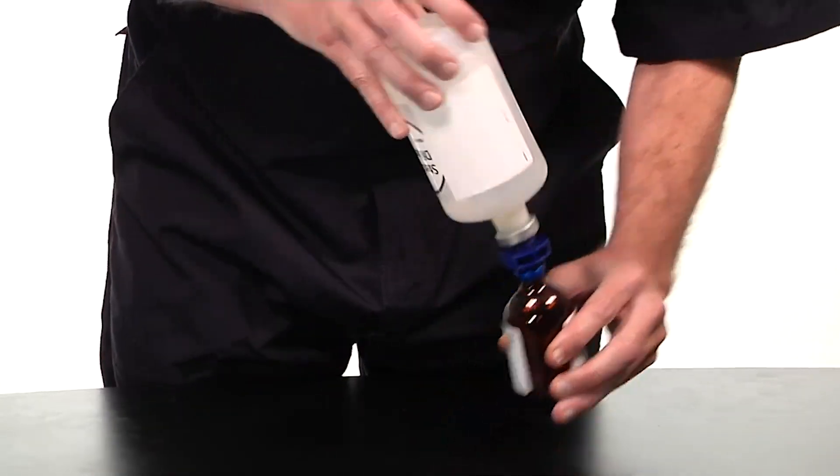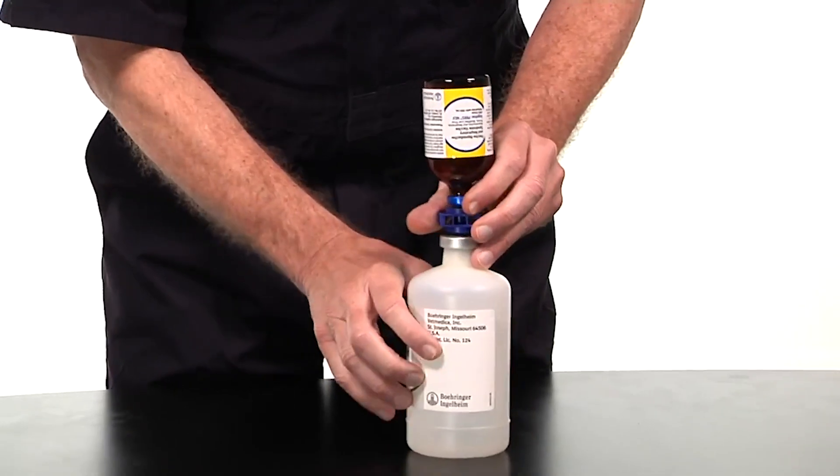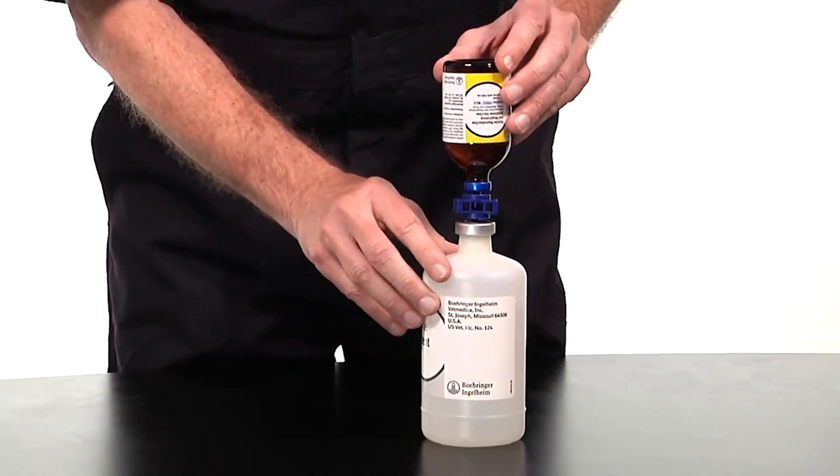With the transfer spike still intact, flip the Ingelvac PERS and sterile diluent bottles so all the product transfers into the sterile diluent bottle.